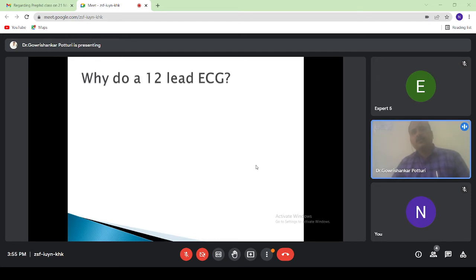Now, as I told you, we always take a 12 lead ECG, 6 limb leads and 6 chest leads. Limb leads are AVR, AVL, AVF, lead 1, lead 2, lead 3. Chest leads are V1, V2, V3, V4, V5 and V6. So in total we have 12 leads. So what do these 12 leads tell us?